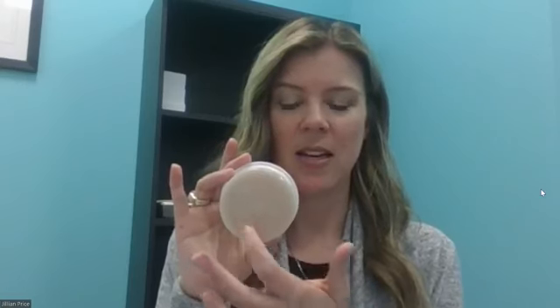And while I'm sleeping, all the moisture is going to evaporate and be absorbed by the drying cup beads that are inside. So these beads are absorbing moisture. They will not last forever though, so you will have to change them.